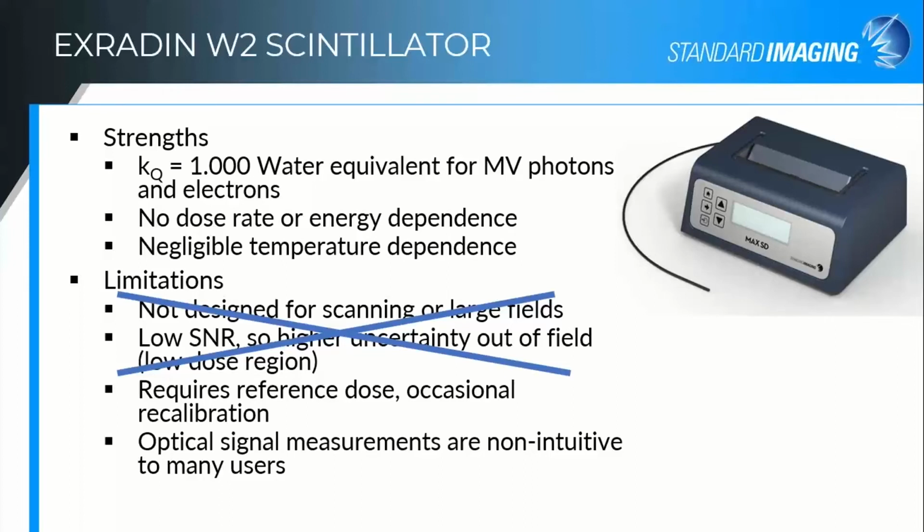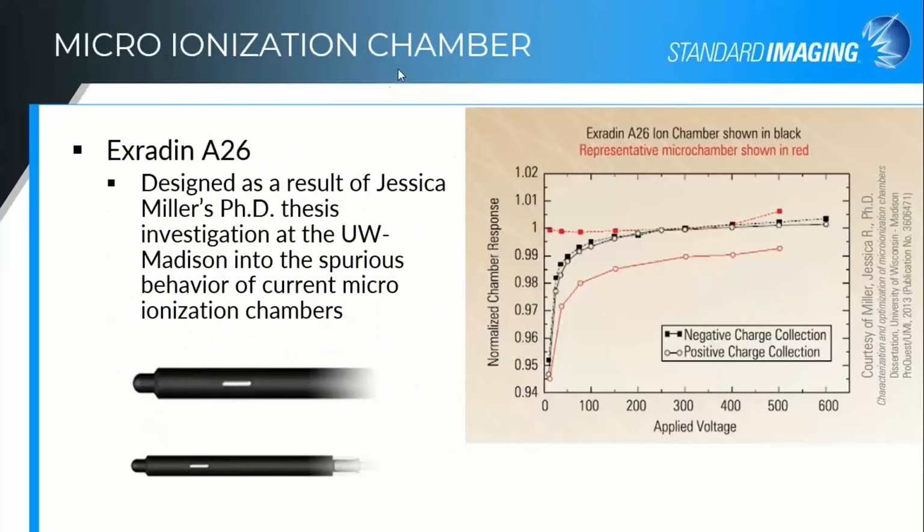And then if you want to do a dose calibration, you give it a known dose, and it creates that conversion between the current that's measured and the dose in that known configuration, so that subsequent measurements can be converted into dose as well. And then if you were to use it for output factor measurements, for instance, it would apply that Cherenkov correction from the saved file that you have created within the system. Hopefully that answers the question.